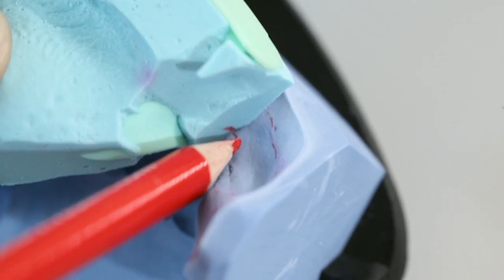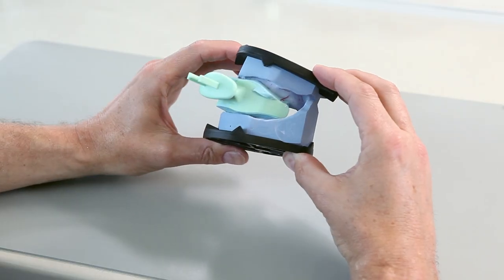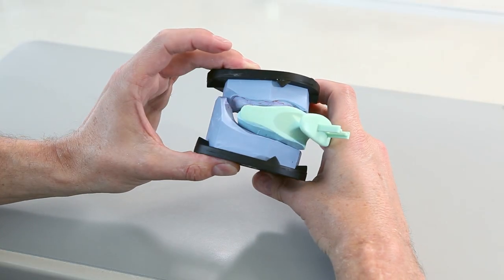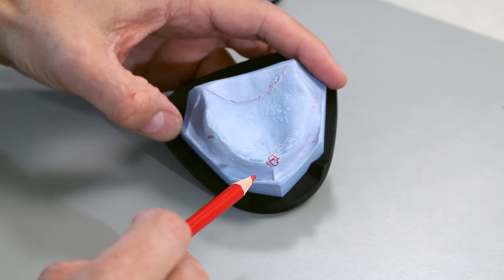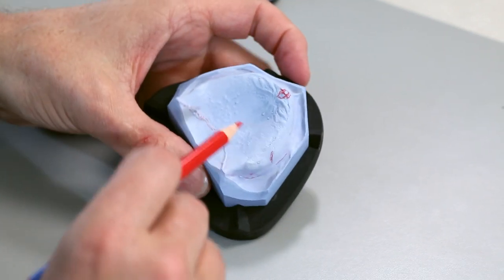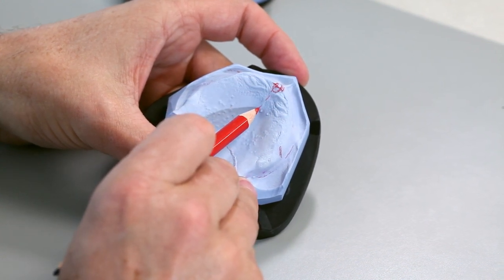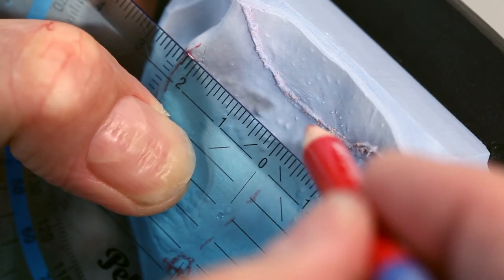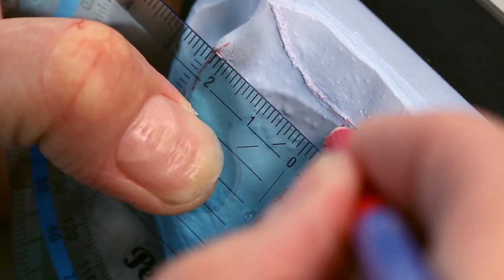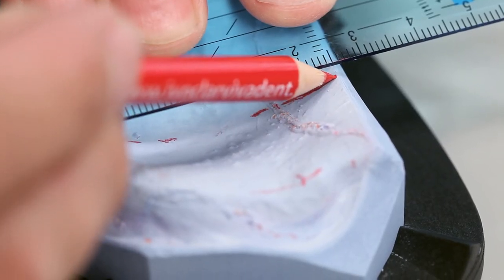Mark the position of the centric tray on the model to support the reproduction of the close-fitting three-point support. The following anatomical reference points are the basis for further working steps: papilla incisiva and the palatine raphe, which forms the anatomical midline. Extend the palatine raphe up to the dorsal area and transfer it to the model edge.